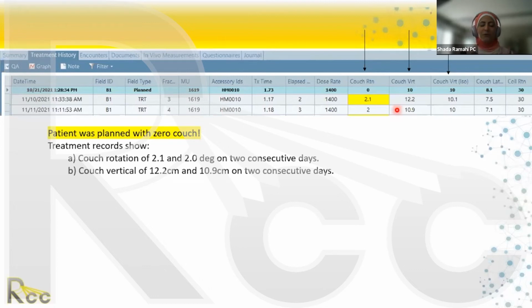Of course, after you do all you can to align the patient well, you would still have those small discrepancies. And when the couch changes itself 6 degrees to align with the tumor, you probably will end up with a 2 degree, or a 3 degree alignment. In this particular planning system, we have something called couch vertical and something called couch vertical ISO. Okay? And ISO is right here. And the couch vertical ISO is 10 as I expected. Well, 10.1, 10, 11 and 10, 11.